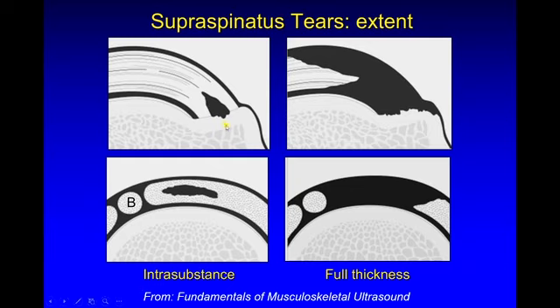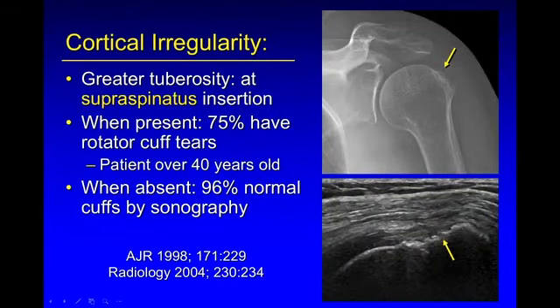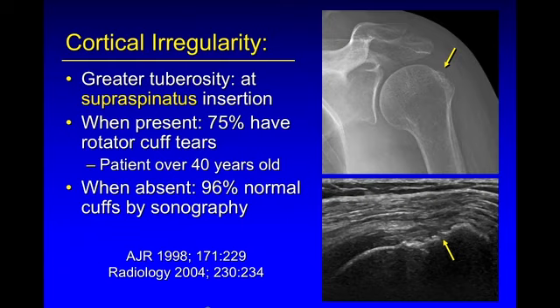Note the bone irregularity, which is a very important indirect sign of a rotator cuff tear. It has been shown that if you see cortical irregularity at the supraspinatus footprint on a radiograph, 75% of those patients will have a rotator cuff tear. If that bone is smooth, 96% will have a normal rotator cuff. We see this bone irregularity very clearly on ultrasound — here the bone is smooth, and there it's markedly irregular at the footprint of the supraspinatus.